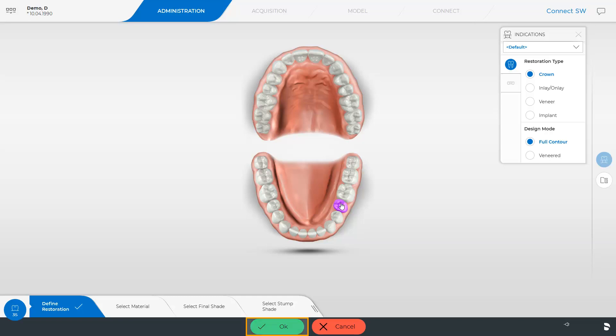After clicking OK, we may already switch to the next phase, the acquisition phase. Alternatively, we can run through all steps of the Step menu if desired. In this way, we can define the material and the color of the restoration or the stump.